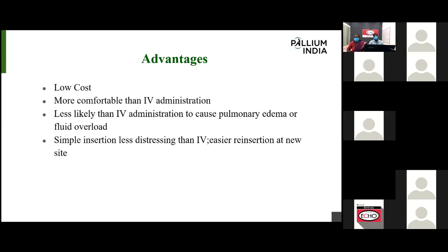With IV administration, either more supervision or more experience is needed for the IV cannulation. But in subcutaneous infusion, limited supervision or a less experienced person can also introduce the subcutaneous needle. For the home care setting also, we can teach the caregiver the subcutaneous introduction or subcutaneous infusion. So it is more comfortable than IV administration.